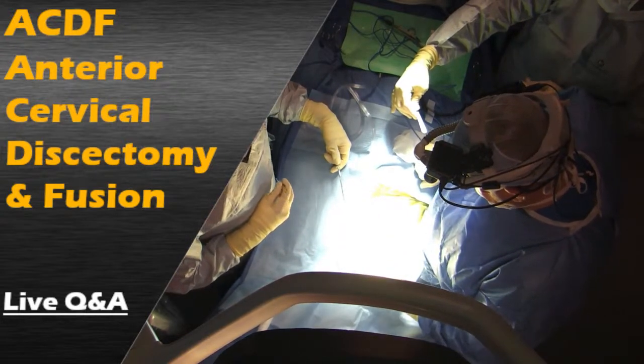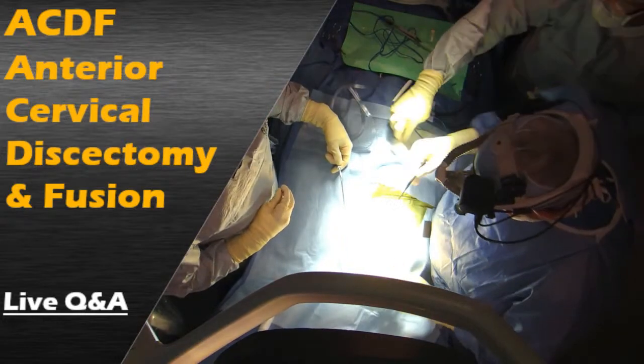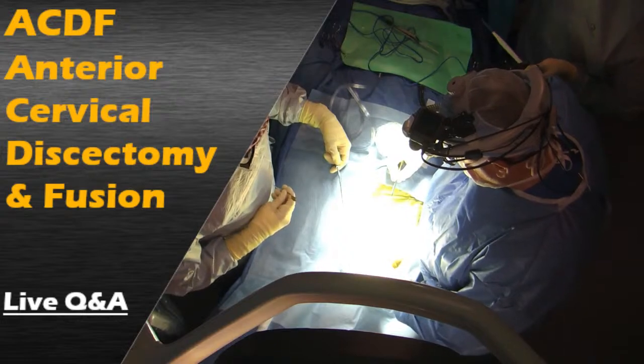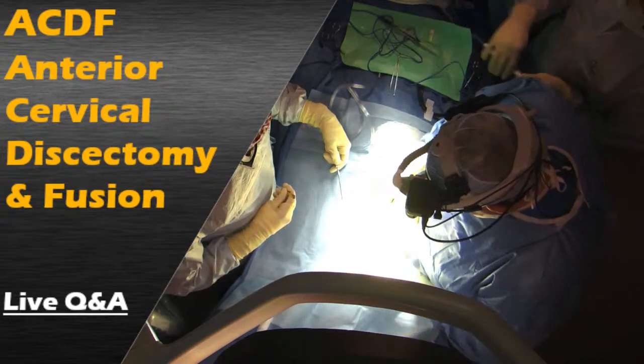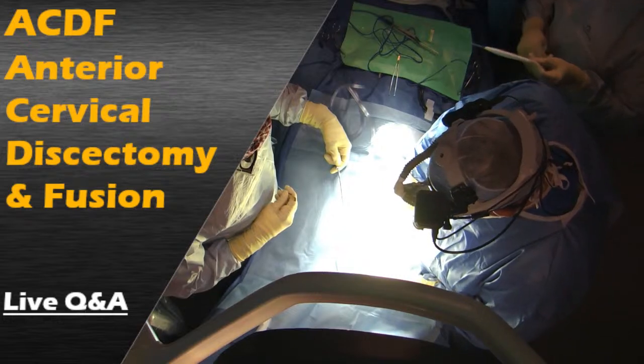So we're going to do an oblique incision, which will give us better access. I'm feeling for his cartilage here. We want to be just medial to the sternocleidomastoid. Incision.